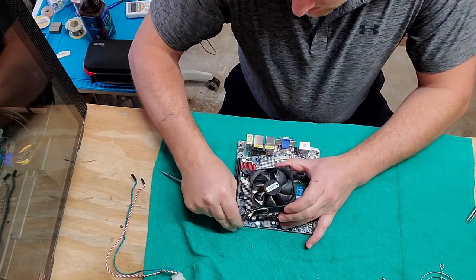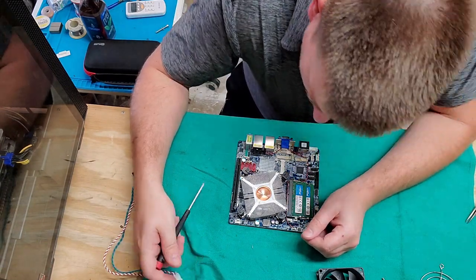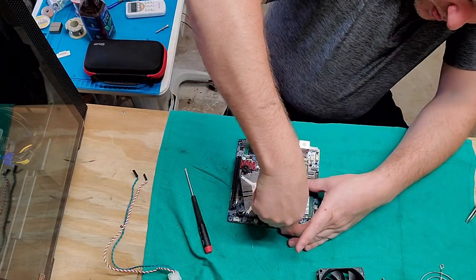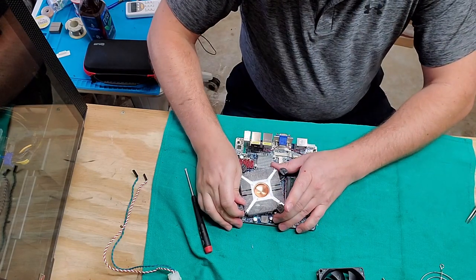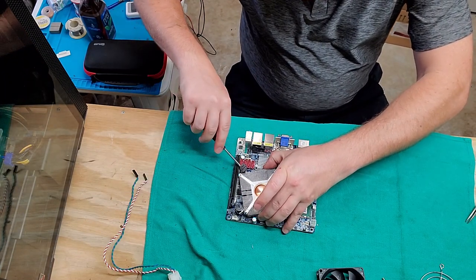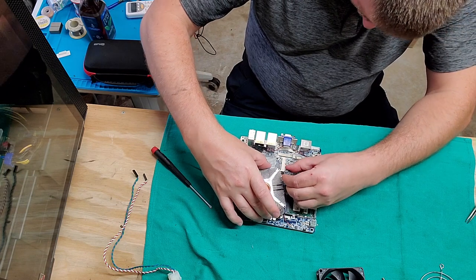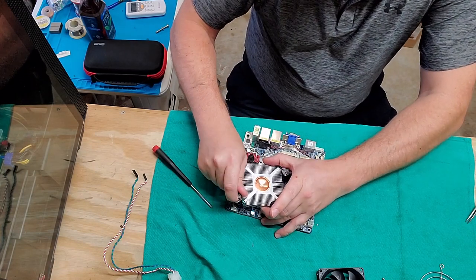There we go. All right, so there's the fan. Oh, nice. You can see the large copper slug in the middle of this guy. These are quarter turn releases. And you should be released. Yep. All right. There it goes. There it goes. Need a little bit of love.